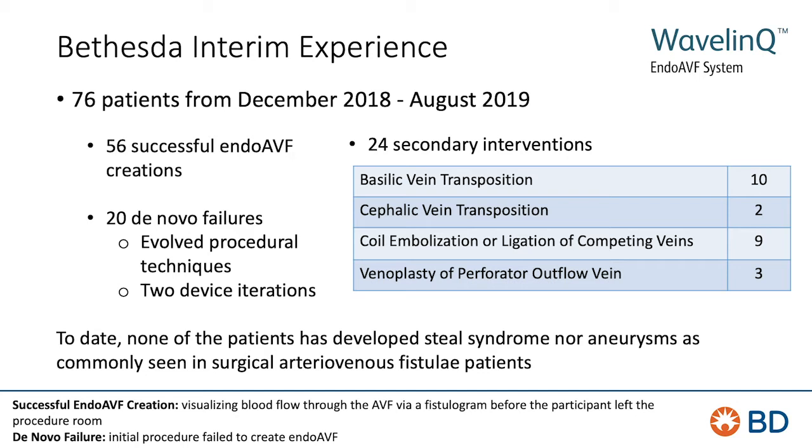We don't cannulate by ultrasound in our area. We don't have registered nurses that cannulate. And the basilic vein has got to be lifted up and stuck right on the top of the arm under the dermis, and it's got to be an easy stick for our technicians to stick. We transposed a couple of cephalic veins. We did have problems with veins popping up that were competing with our target vein for flow, and we went back and coiled them in an effort to try to redirect flow.